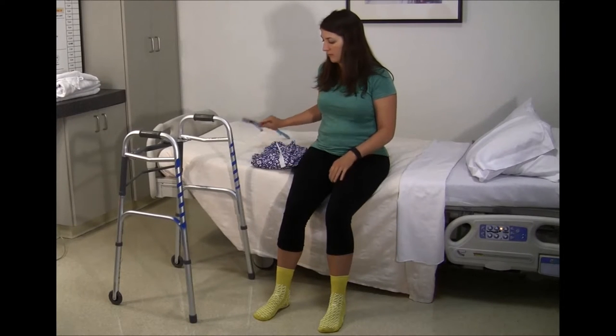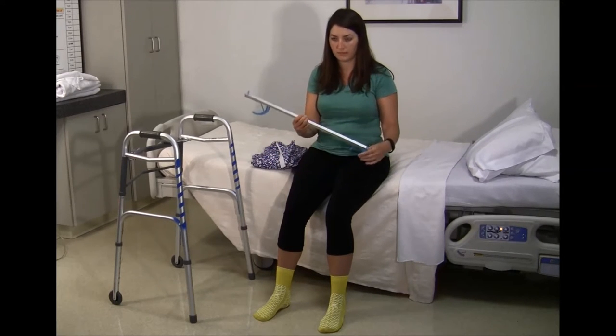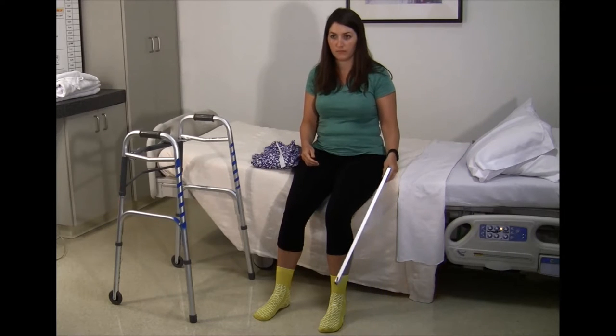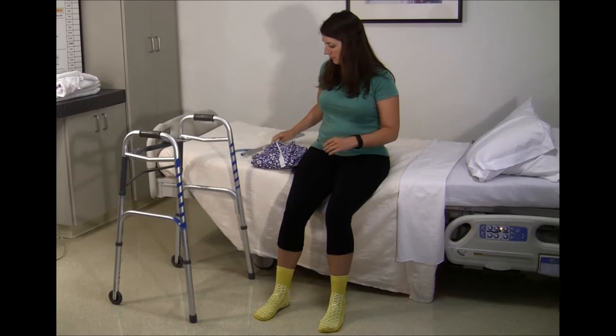A reacher is a piece of adaptive equipment used to assist with tasks such as getting clothes on and off, taking your socks off, and picking up items that may have fallen to the floor. A reacher is mandatory for patients with a hip replacement, but can also be used for knee replacement patients if needed.